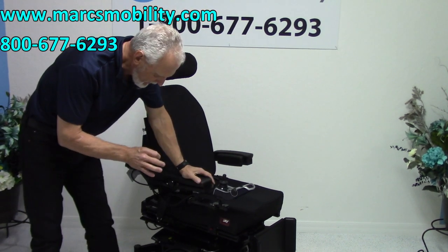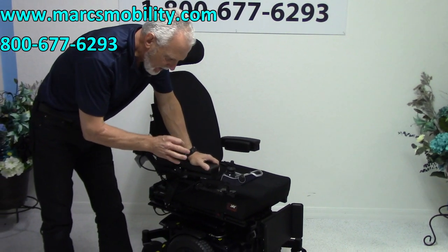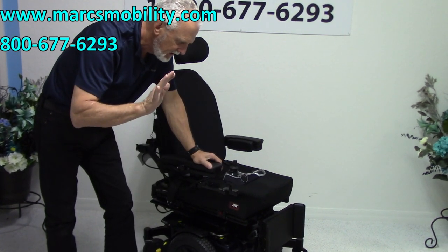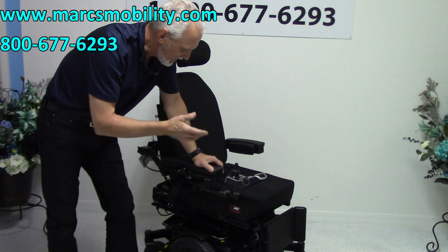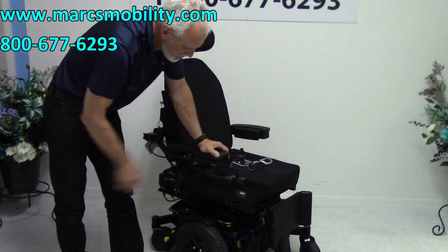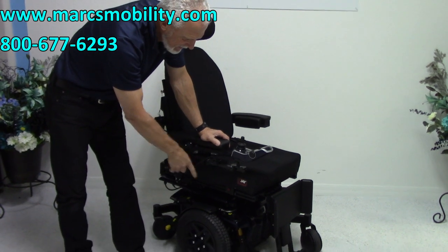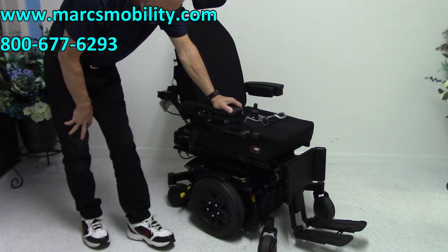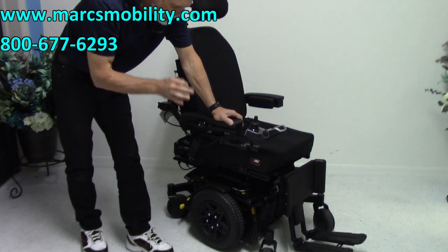So let's recap. If you're looking for the latest power chair but you only need the 12-inch seat lift and the tilt, and you want a chair with two miles, swing-away joystick, gel cushion, the light kit, and calf support to keep your leg on the foot plate — in new condition — this would be a really, really nice one.